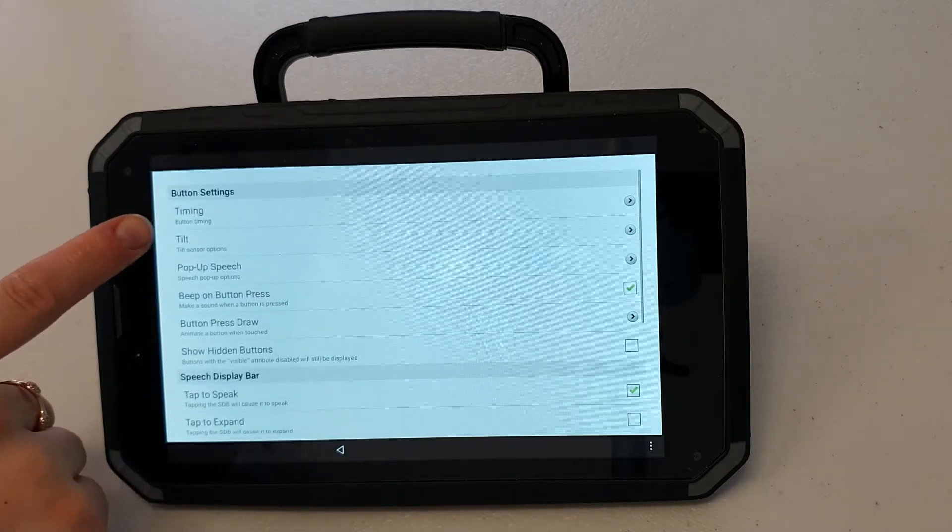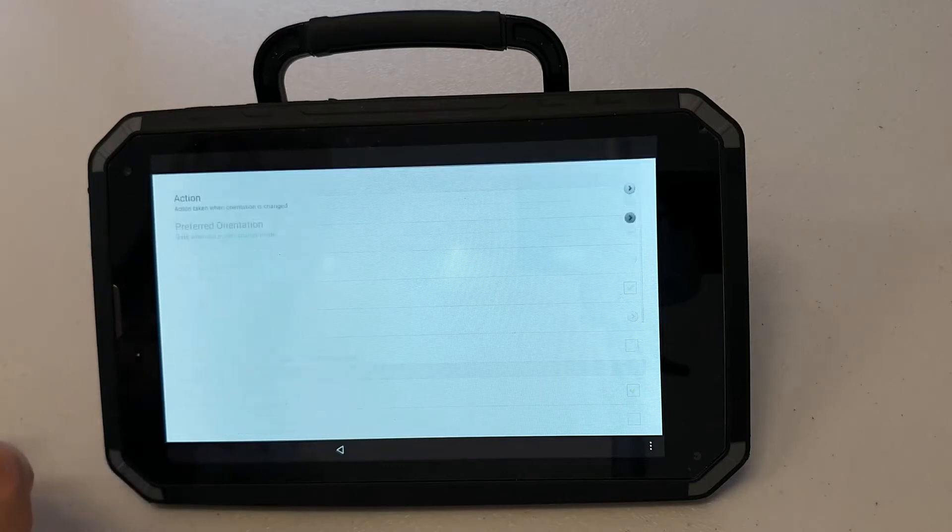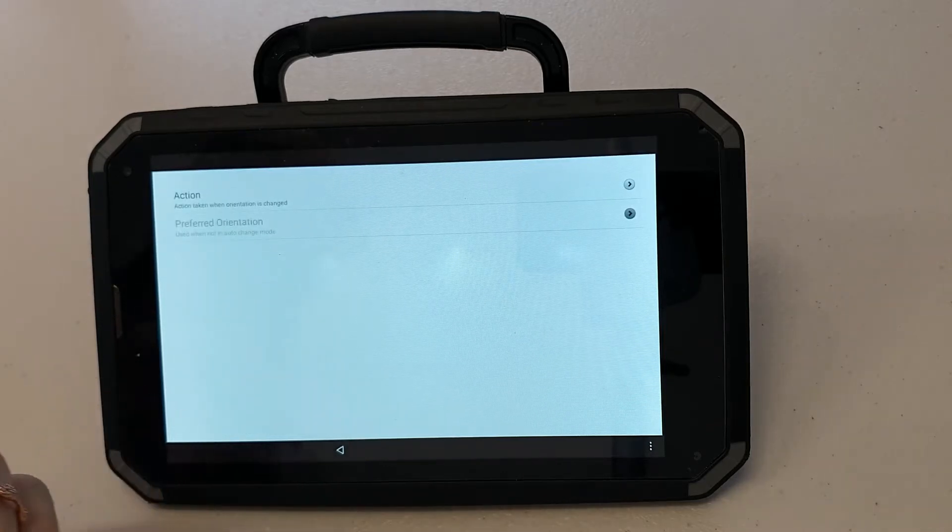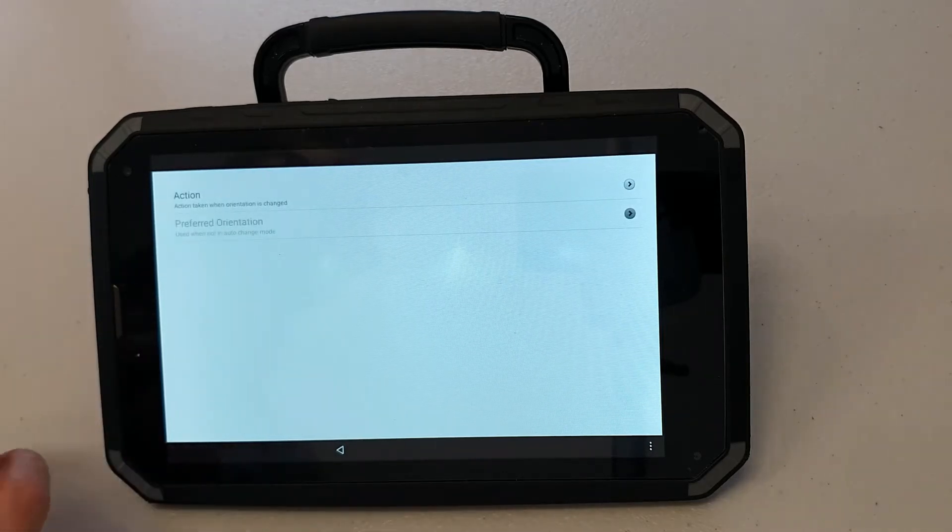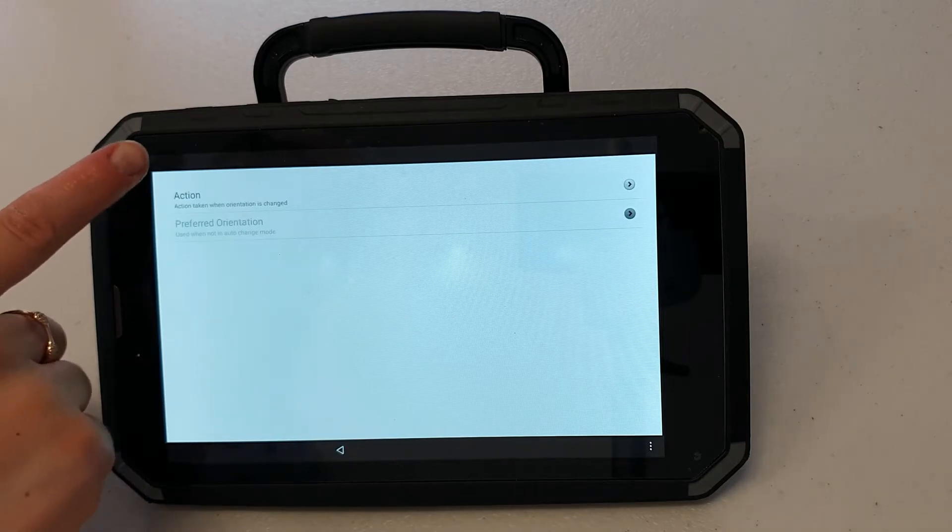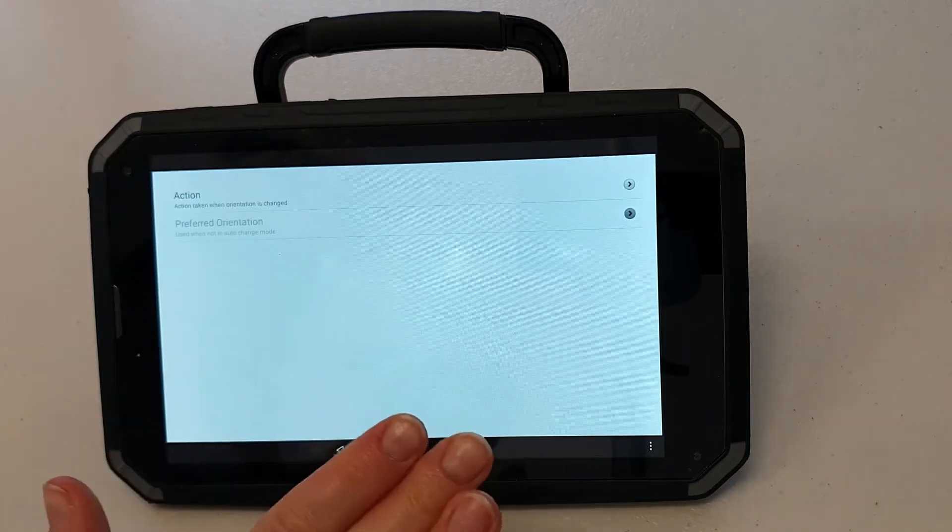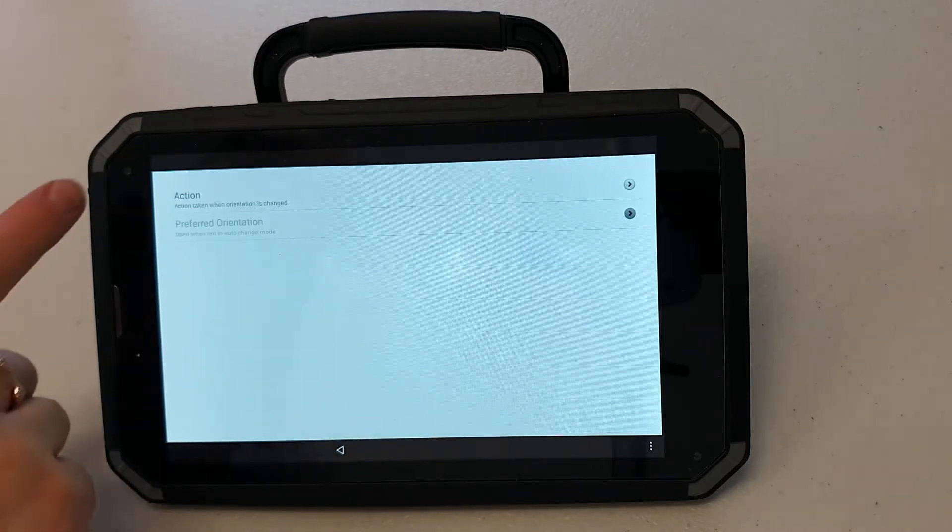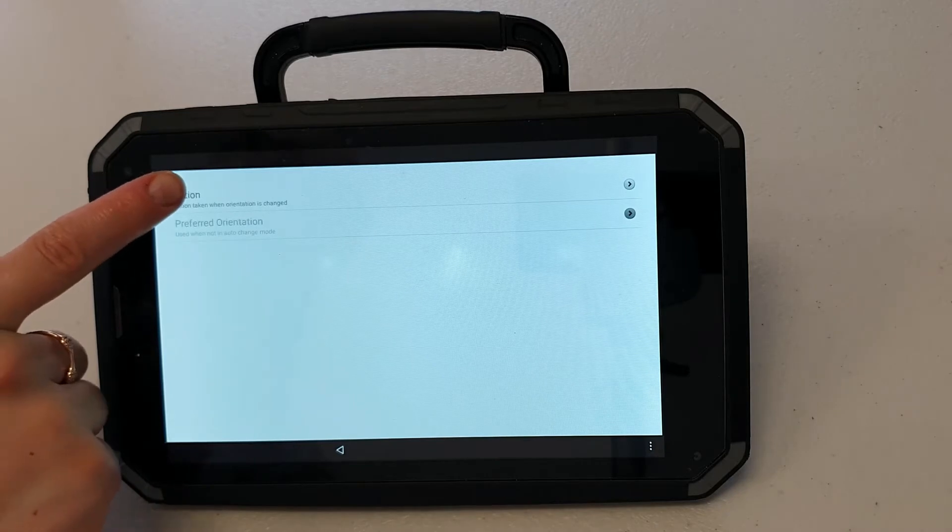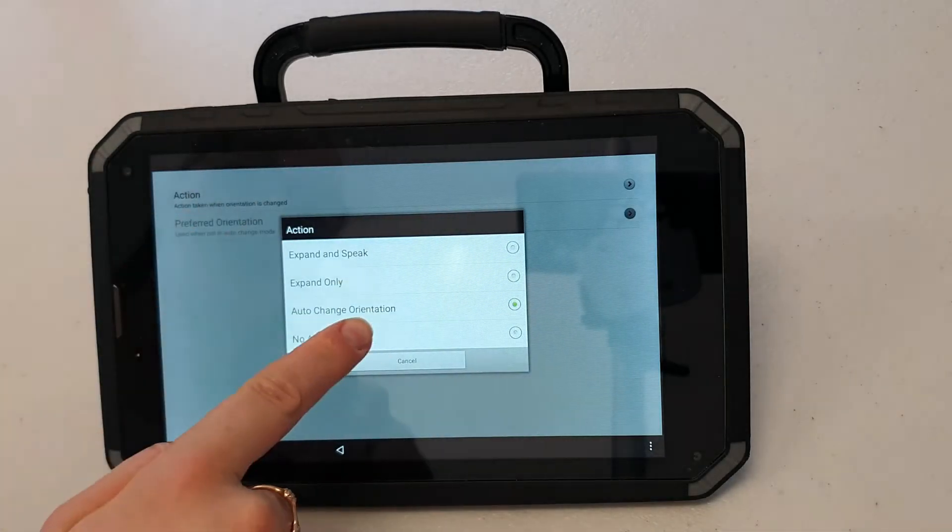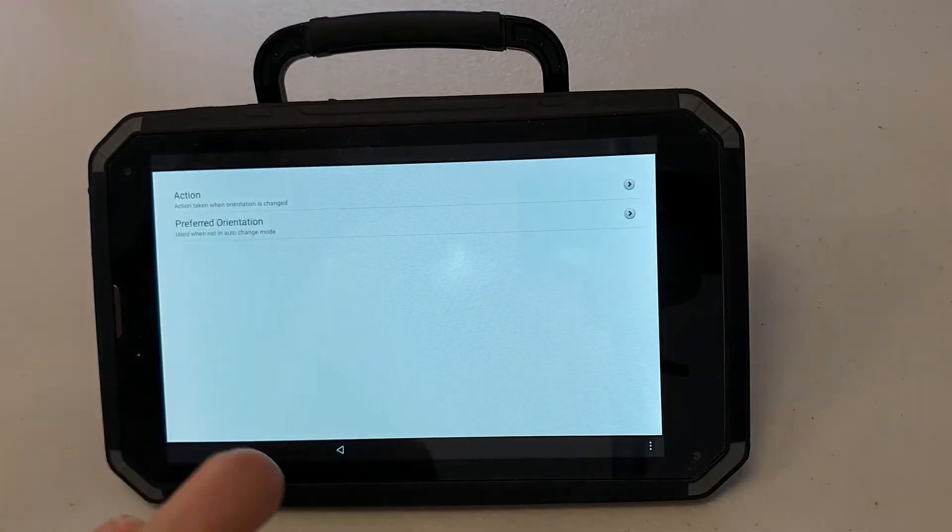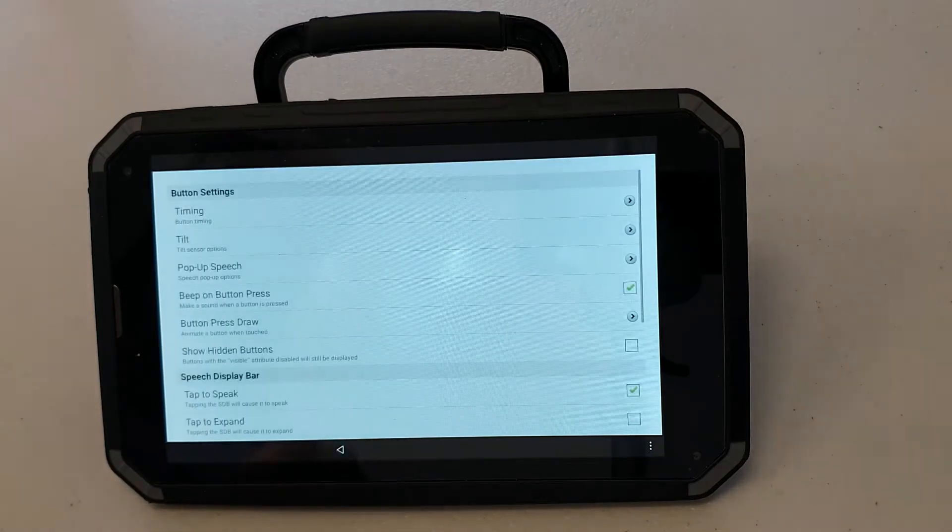Next I'm going to go to tilt. At the moment when I turn the orientation of my screen it will change between portrait and landscape. I want to keep it in landscape so it's locked there. So I'm going to press action, no action. This will stop my screen from tilting when I move my device.